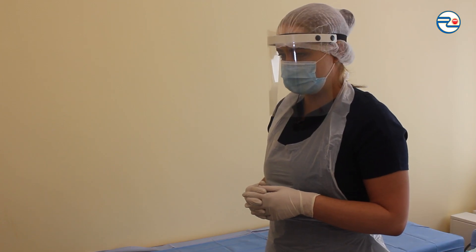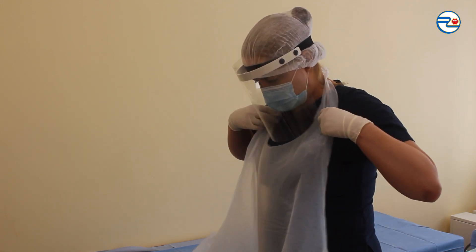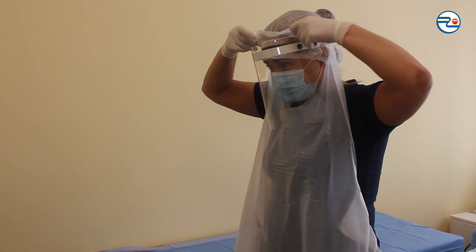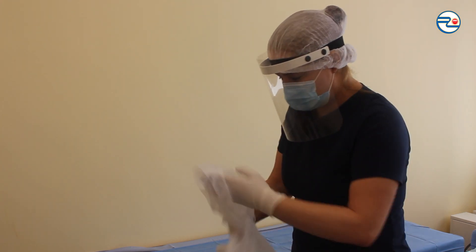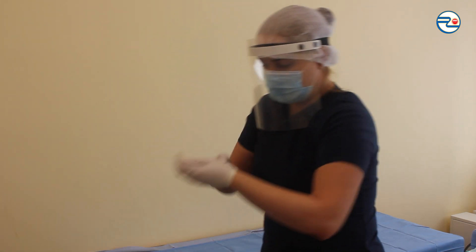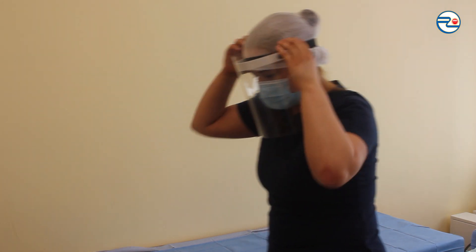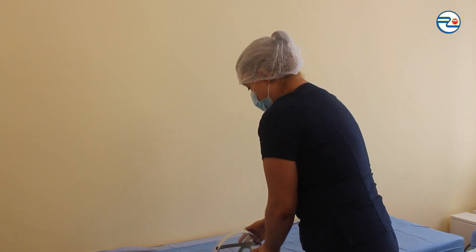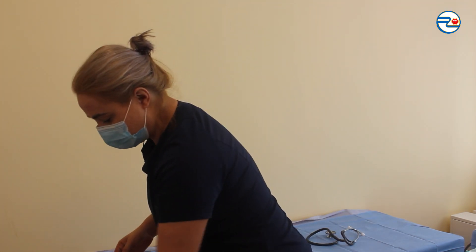Removing personal protective equipment: apron, throwing it to the infected waste bin; disposable diagnostic gloves, throwing them to the same bin; removing shield; removing cap and mask and throwing them to the same bin.